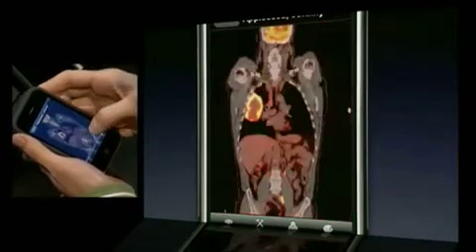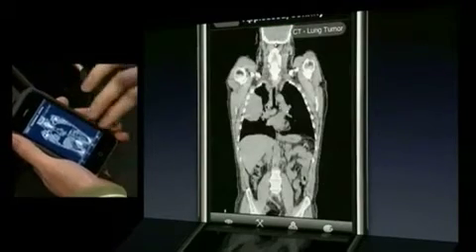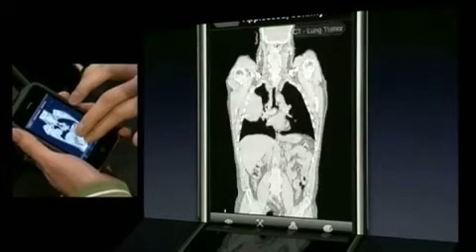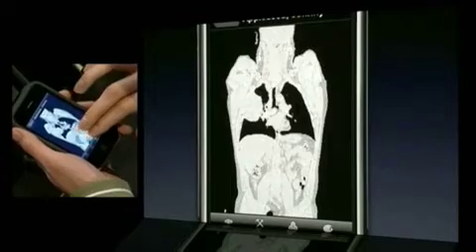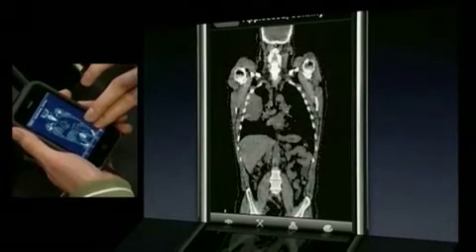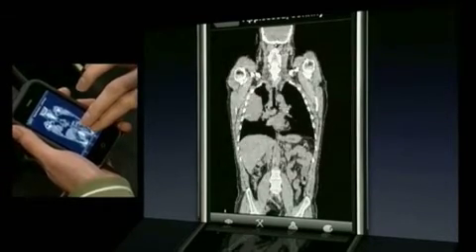The swipe is the quick way to transition between volumes. And when you're viewing a single volume, the two-finger slide changes the contrast, or window and level — an important tool for visualizing such a wide range of data.